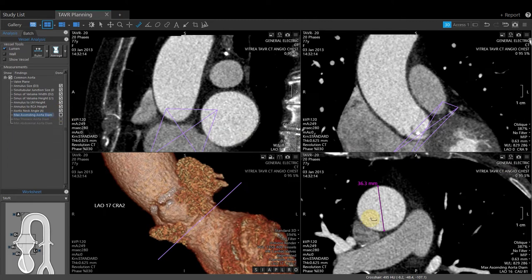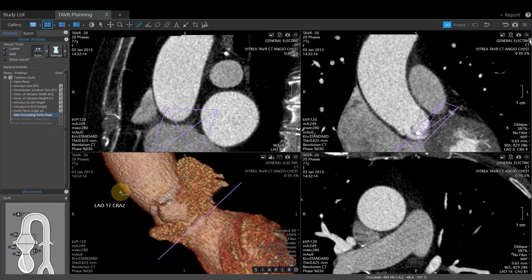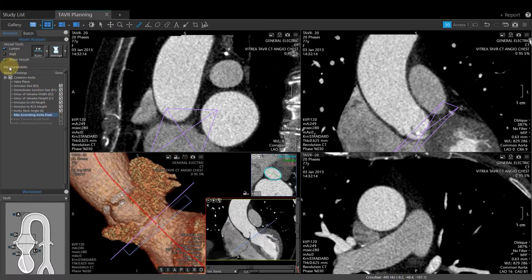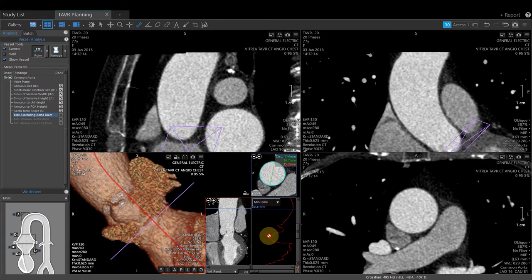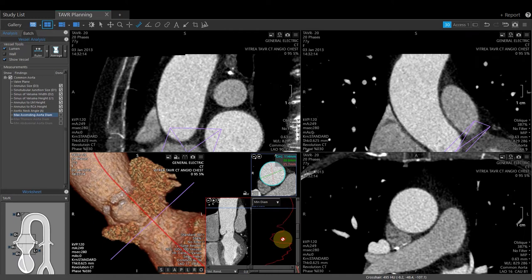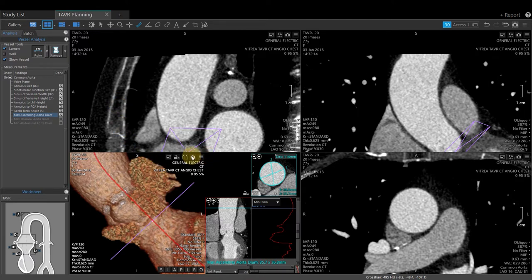That was the 2D MPR method. The other method is to use the probed vessel. Click 'Show Vessel' in the Vessel Analysis area at the upper left. View it as a straightened vessel by changing the view. Note the histogram — left-click and drag the purple line using the histogram to aid in visualizing the maximum diameter. Once at that point in the short axis view, left-click to document the max and minimum of the ascending aorta. Edit as needed, click Done, and take a snapshot. Use whichever method your facility prefers.